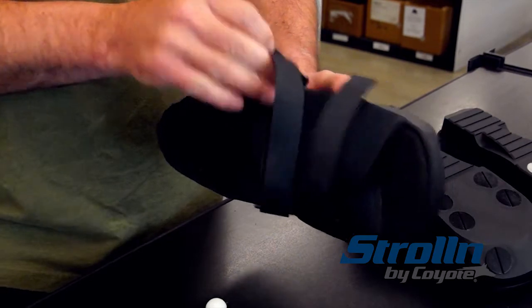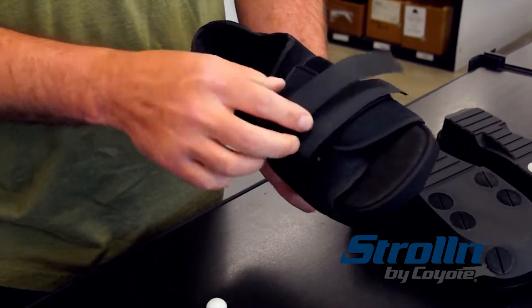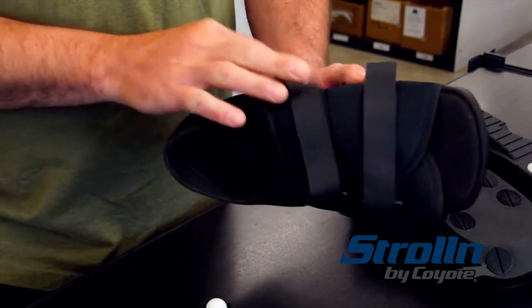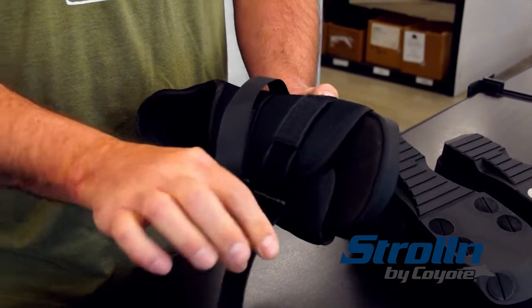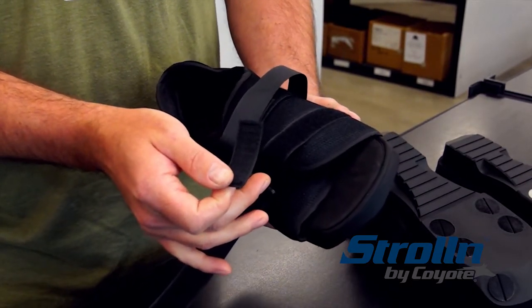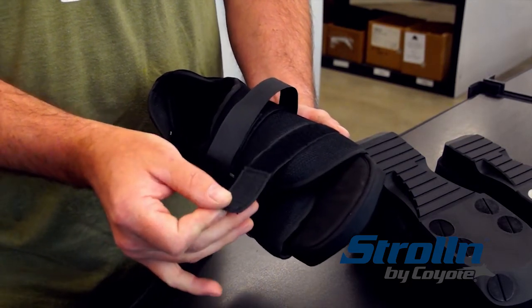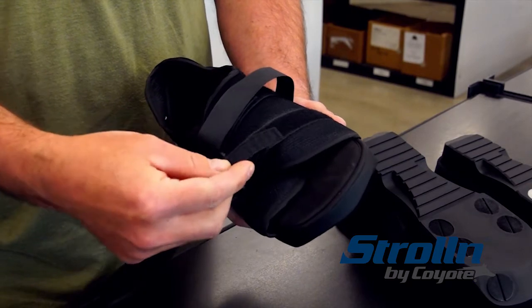If the patient has a really small foot, you can move this piece of Velcro to really close. That way you get the Velcro to work. So that's how you do that. It's customizable to the size. You can also wear multiple socks if the fit isn't just quite right, but that piece of Velcro is movable, so you can move it wherever you want.